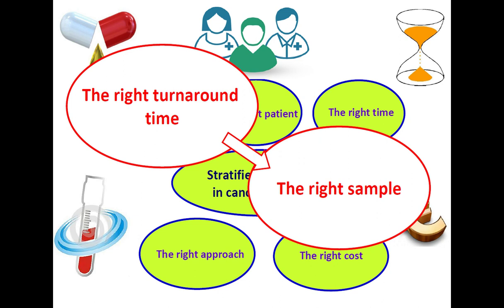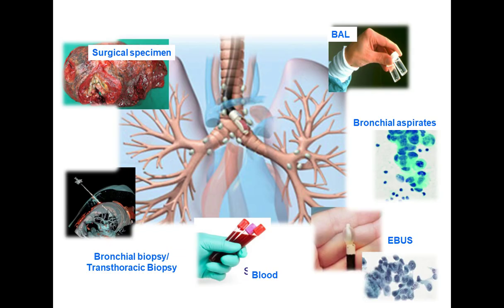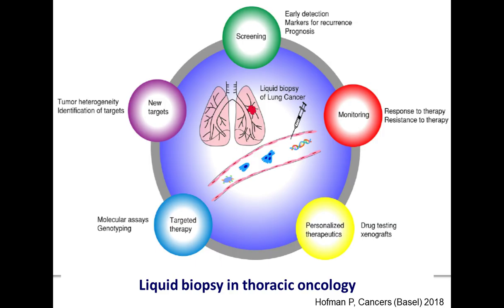And since some non-invasive liquid biopsy may be used in certain situations, we have also to take into consideration the nature and the quality of the bioresource used for genomic analysis. In this context, many samples can be used for molecular biology technologies such as tissue biopsy, cytological samples, and some biofluids, in particular blood samples.